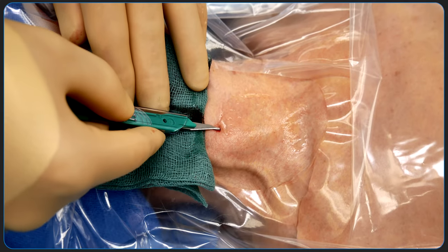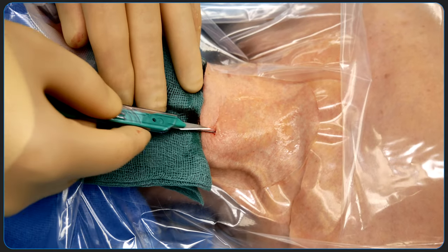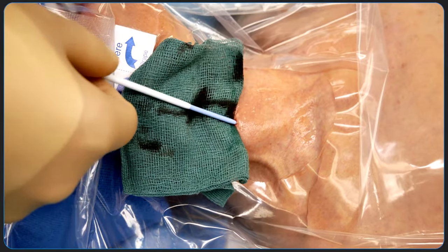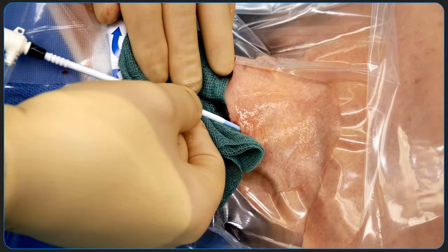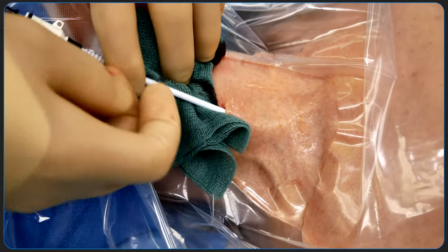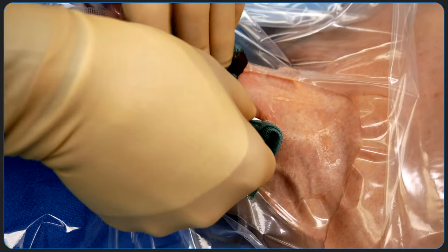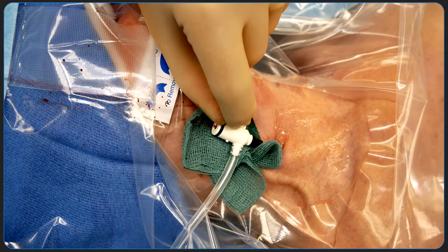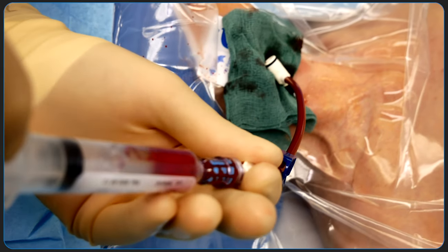Insertion of a PSI catheter is performed in a similar fashion. A scalpel is used to create an incision parallel to the guide wire. A PSI catheter with a preassembled dilator is loaded onto the guide wire and advanced toward the skin. The unit is similarly advanced together through the skin incision using an alternate hand for counter traction. The guide wire is checked again before the catheter is advanced over the dilator into the tract. The dilator and guide wire are then subsequently removed together and the side port of the introducer is aspirated and flushed with sterile saline.